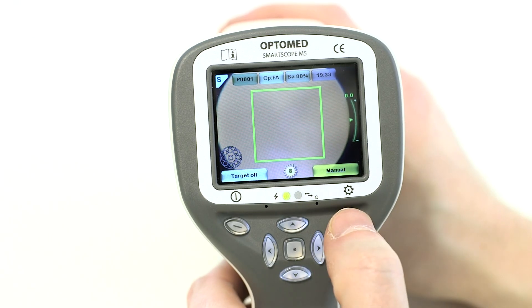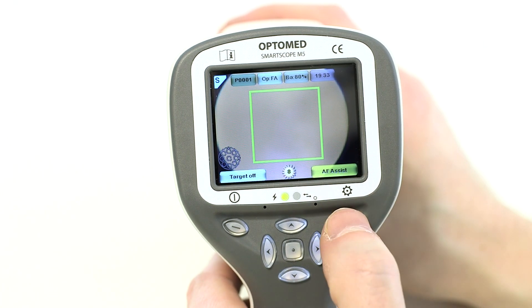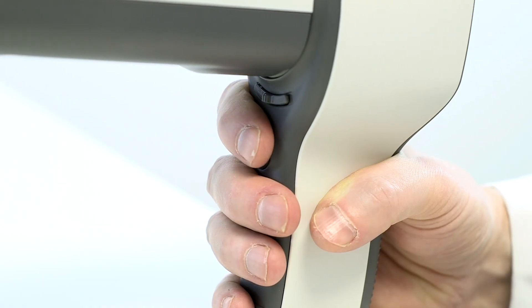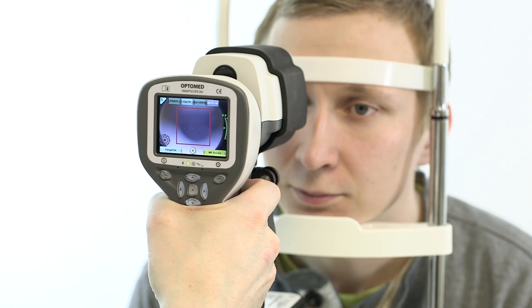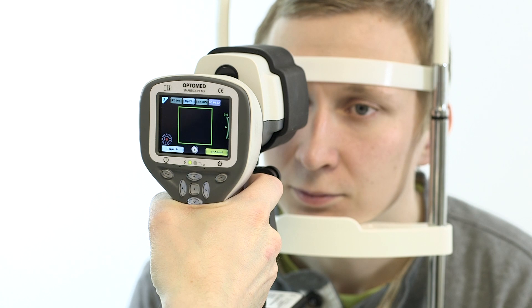When AF or MF assist mode is selected, the camera will take an image automatically when the aim help square has turned green. The shutter button must be kept down until the camera focuses and an image is taken. Otherwise, AF assist mode works the same way as autofocus and MF assist mode as manual focus.